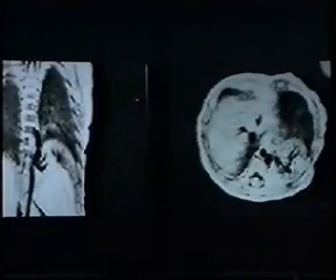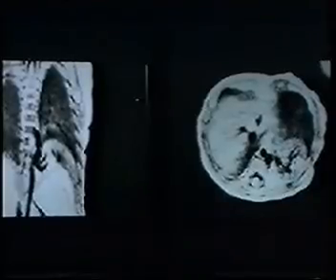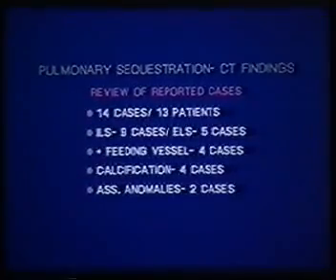Now, I was in Sun Valley last week, and I showed this case and made the observation that in our institution now, if we suspect sequestration, we immediately go to MR. And he said, well, I had a case, this particular course participant, where it wasn't as easy as you're describing, Dr. Nadich. Why do we do the MR? We do the MR because I think the CT can be very difficult to interpret, and I made that point.